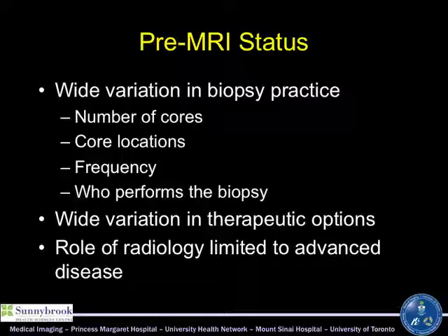But I learned that this primarily sits in the field of the urologist to do the biopsy. But as I got into it more, I saw a wide variation in practice in the number of cores being obtained with biopsy, core locations, and how these schemes are done, drift in these numbers and approaches. And so that was the status when I came in.